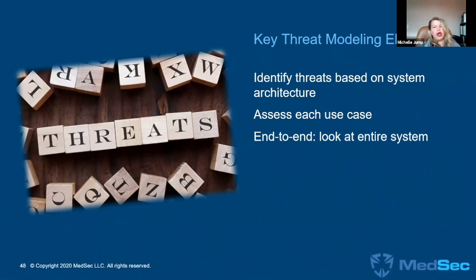So when I think about threat models, completely agree with everything that Stephanie says. I don't build threat models. I use them as a source of information for creating a good, solid argument that you've done your job with risk management. So when I think about threat modeling, I think of some key things that threat models are used for, to help create that evidence.